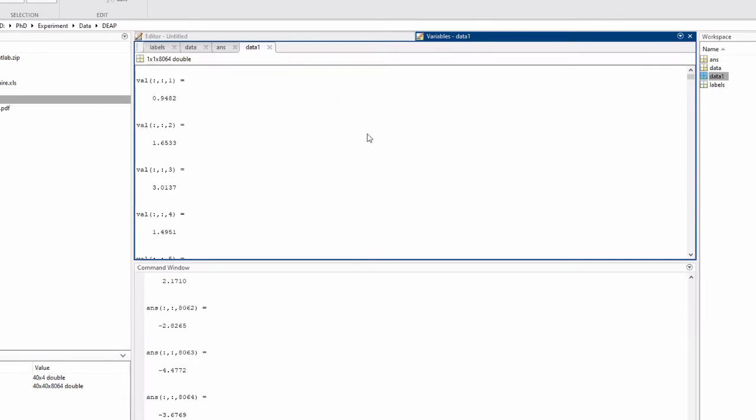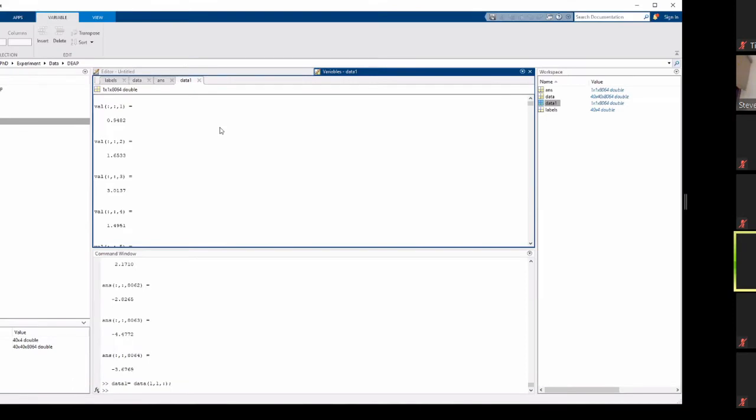You store this and just simply go through what we did in stage 1 and 2, where you filter out the noise and perform a spectral analysis. After that, for EEG signal, normally you will separate the EEG signal into alpha, beta, theta bands. With different bands, you have different meaning of that EEG signal, and then you can start to think about how to do the feature extraction in order to increase the overall classification accuracy. And I think that's pretty much what I want to talk about for today.